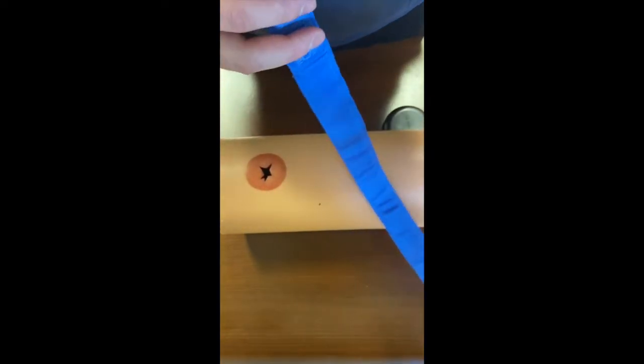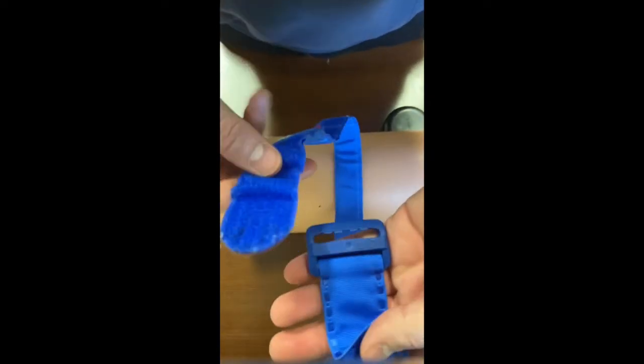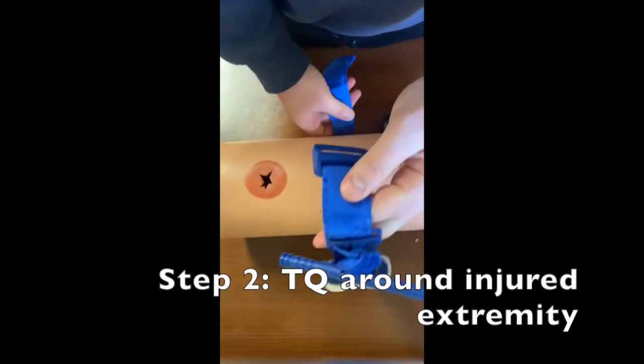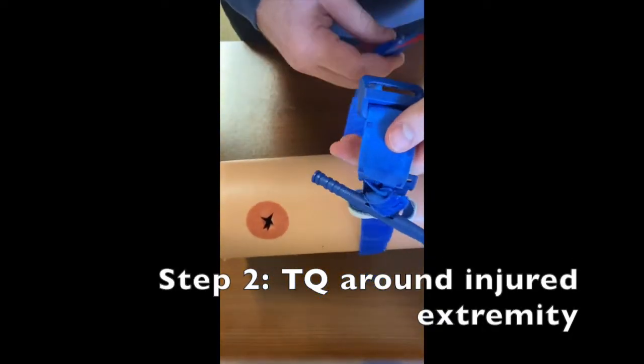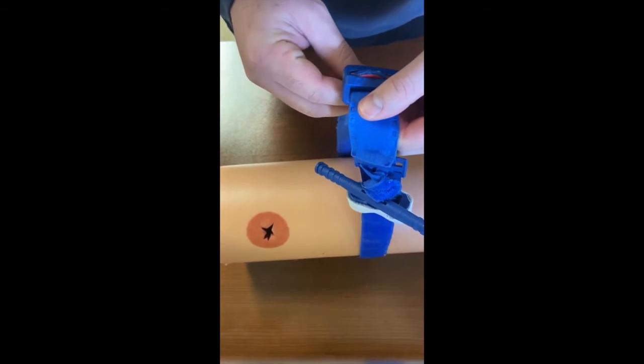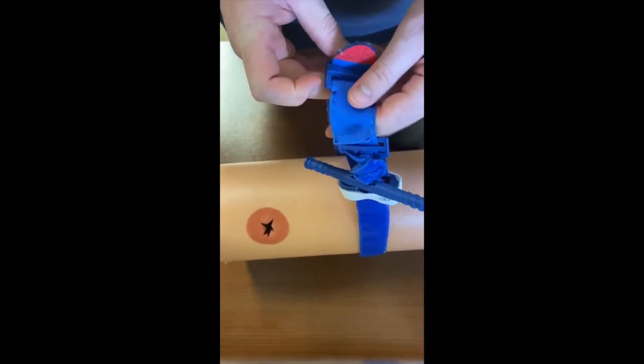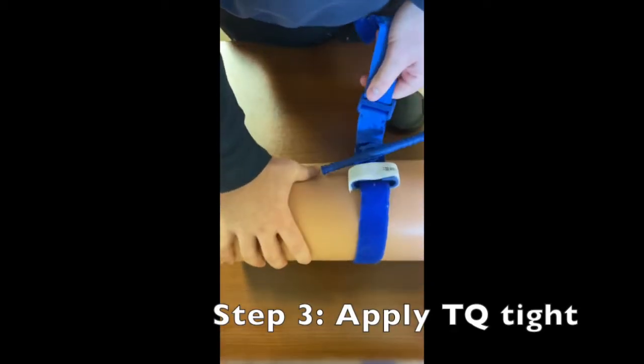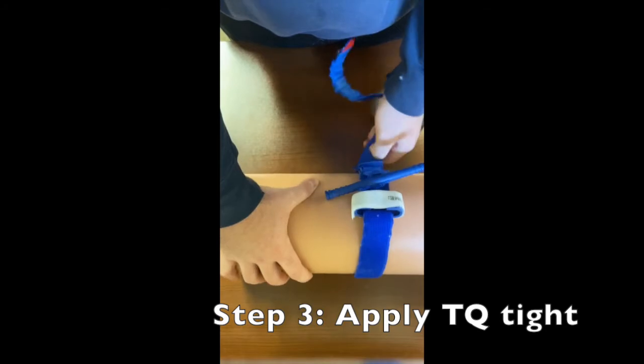We're going to want to make sure that it's undone like this so we can get a good tight tourniquet. We're going to go around and we're going to slide it under. You always want to go about 2 to 3 inches above the wound site, but never on a joint. So if their knee was there, you would want to go above the knee.